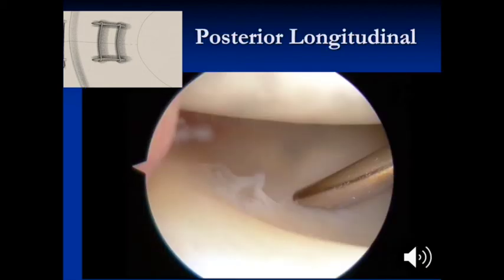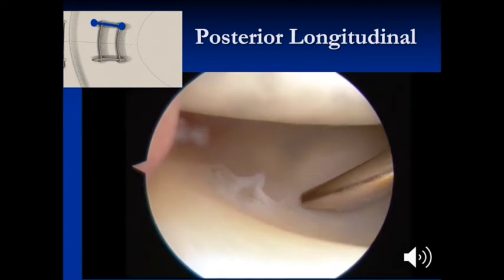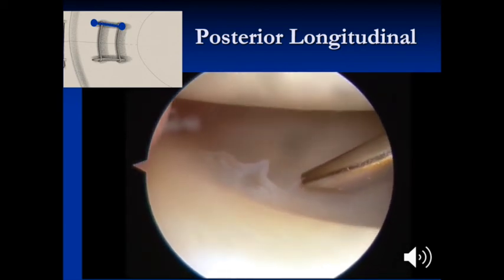The first step in this video is the posterior longitudinal suture. The tear is oriented with the dotted red line, and first the suture will be placed at the inner aspect of the meniscus.